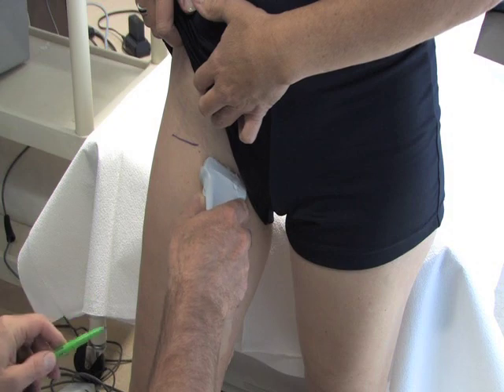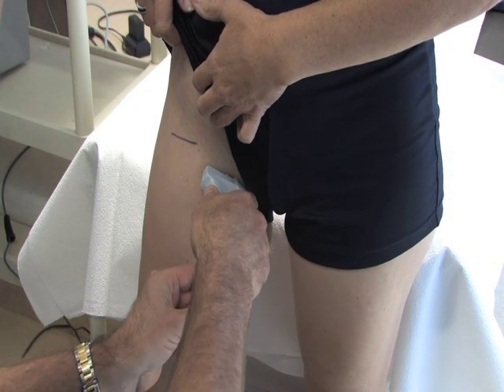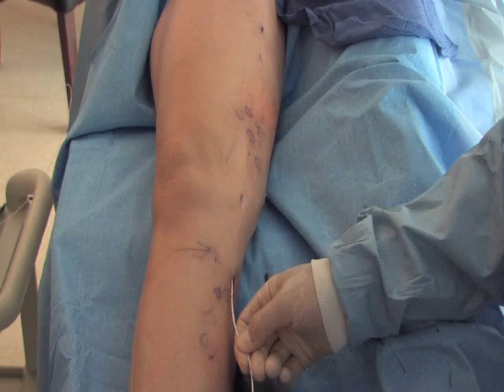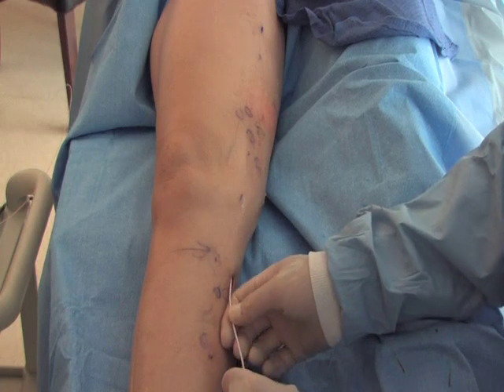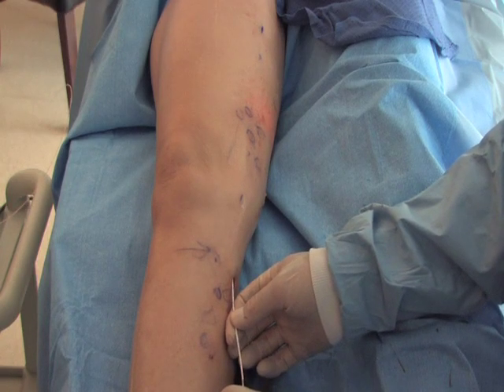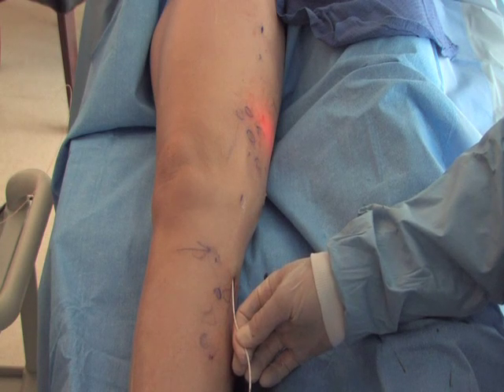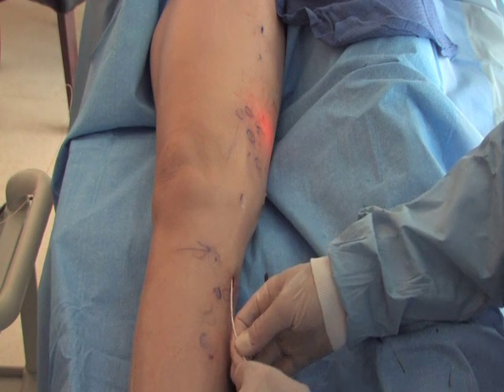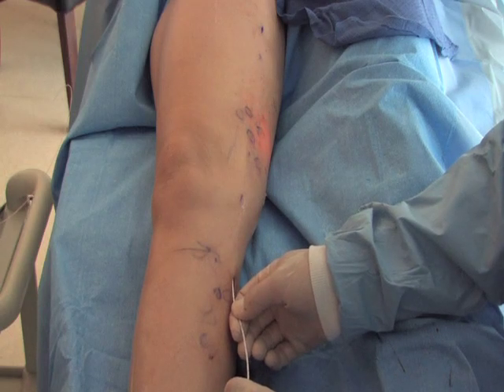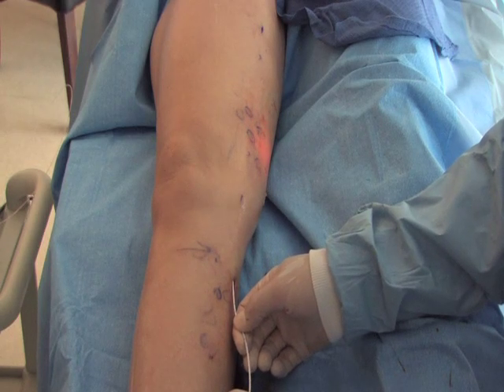EVLT is a minimally invasive procedure that can be performed in the office. Compared to surgical stripping, the traditional method for treating varicose veins, EVLT does not require general anesthesia and has significantly lower risks of surgical complications such as bleeding and infection.